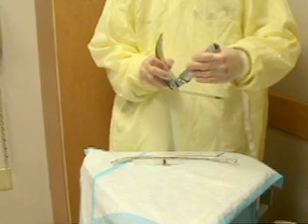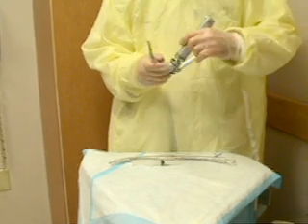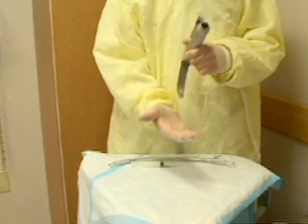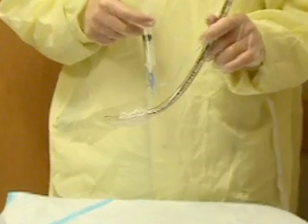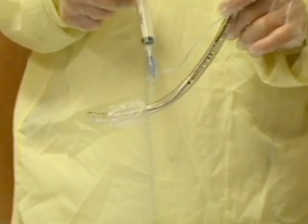Since nasogastric intubation may induce emesis, patients who are unable to adequately protect their airway should be intubated with a cuffed endotracheal tube if the procedure must be performed.